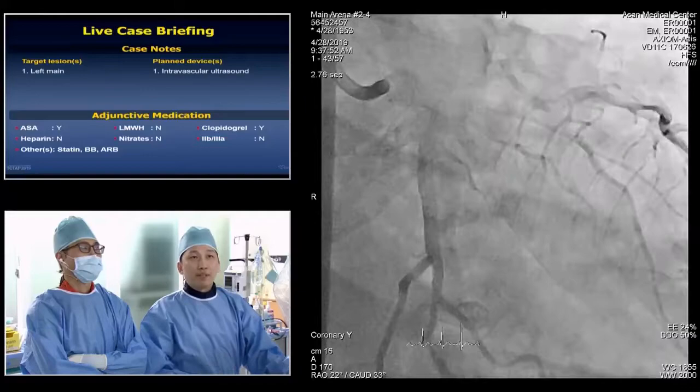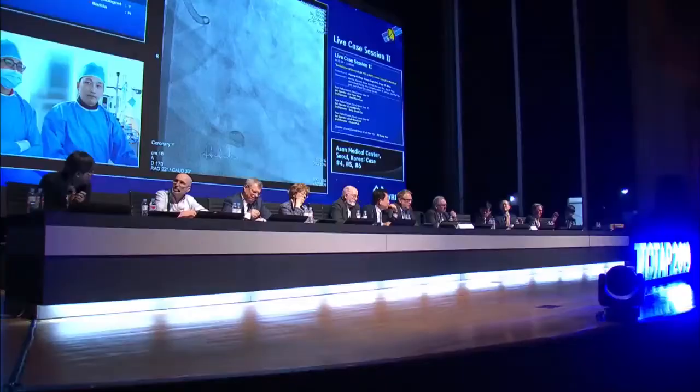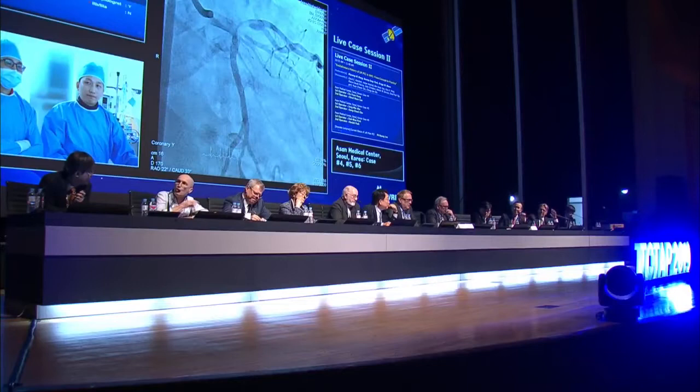The patient is stable now. So in our center, we would certainly offer this patient at least a discussion of coronary bypass grafting. He's 66, he's got a very complex looking left main with a discrepancy into the proximal LAD. It's functionally significant. We know that the only intervention that makes a difference to life expectancy is a patent mammary on the LAD. This is a young man at 66 with diabetes. So, as opposed to the first case here, we would definitely discuss more carefully whether this patient should be offered bypass grafting.